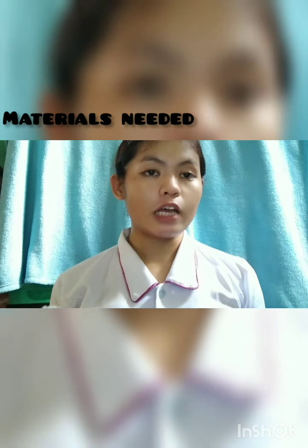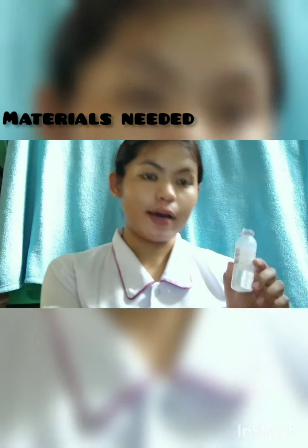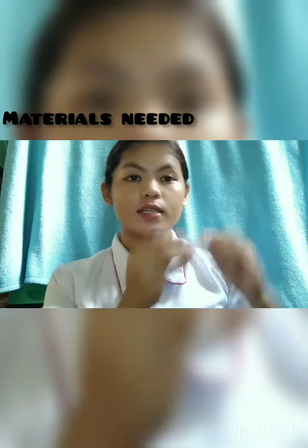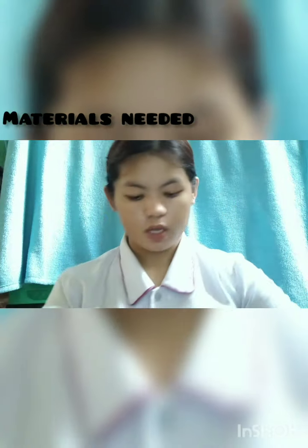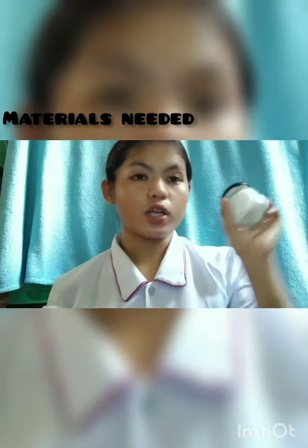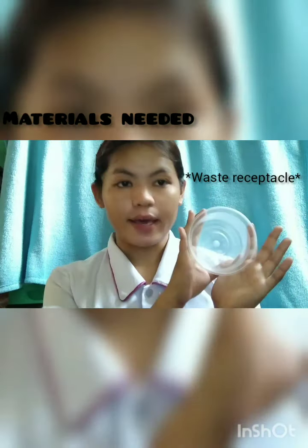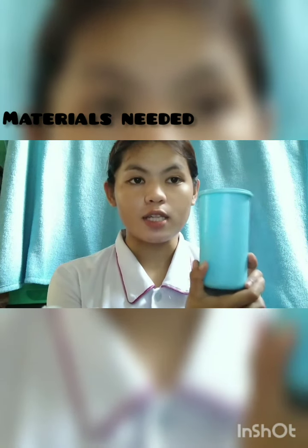The materials needed for this procedure are sterile water, this will serve as our medication vial, medication ticket, sterile needle, it is for aspiration, sterile syringes, working gloves, bandage, cotton balls that are soaked with 70% alcohol, recycle bin, and sharp container that contains the used needles. It is to avoid needle stick injury.